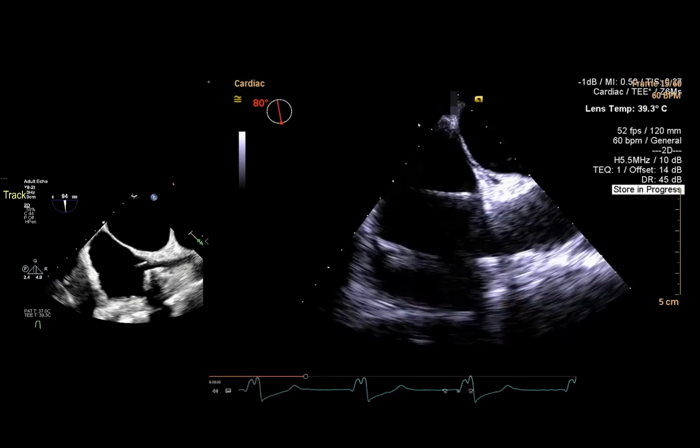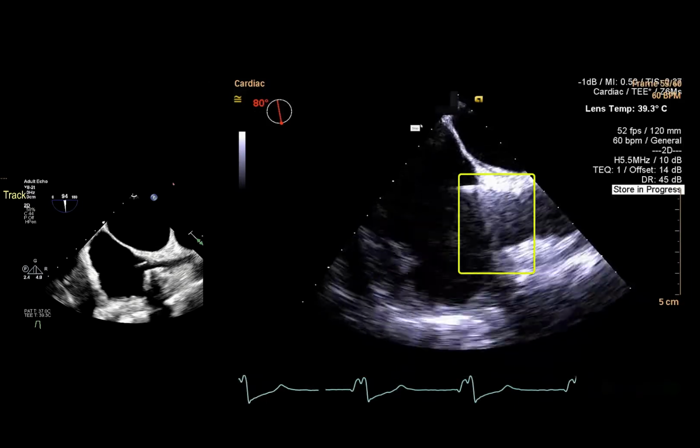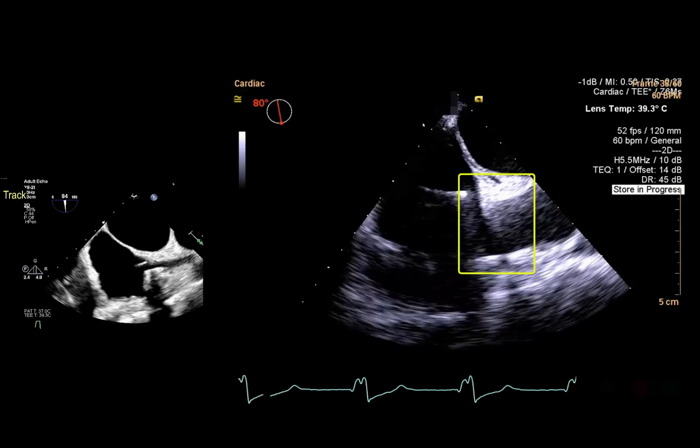In this image, which is not of this patient specifically, you can see the reverberation artifact of the tip that tracks and moves with the motion of the needle. I'm sure with your experience you have developed some other trick besides this to find it. But the most important is to identify the continuity and to be absolutely certain that this is the tip of the needle. Yeah, very good.